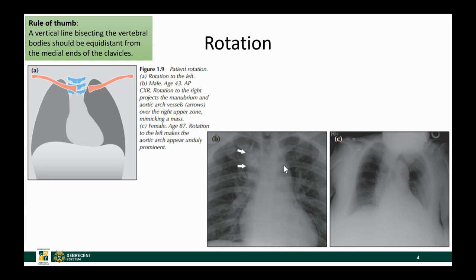Here are two examples. In the first case, the patient is rotated to his right because the distance from the spinous process to the right clavicular head is larger than to the left. This creates an apparent mass which is not a true mass — it's just due to patient rotation. In the second image the heart appears quite large and mediastinal structures are not near normal because the patient has been rotated to his left.